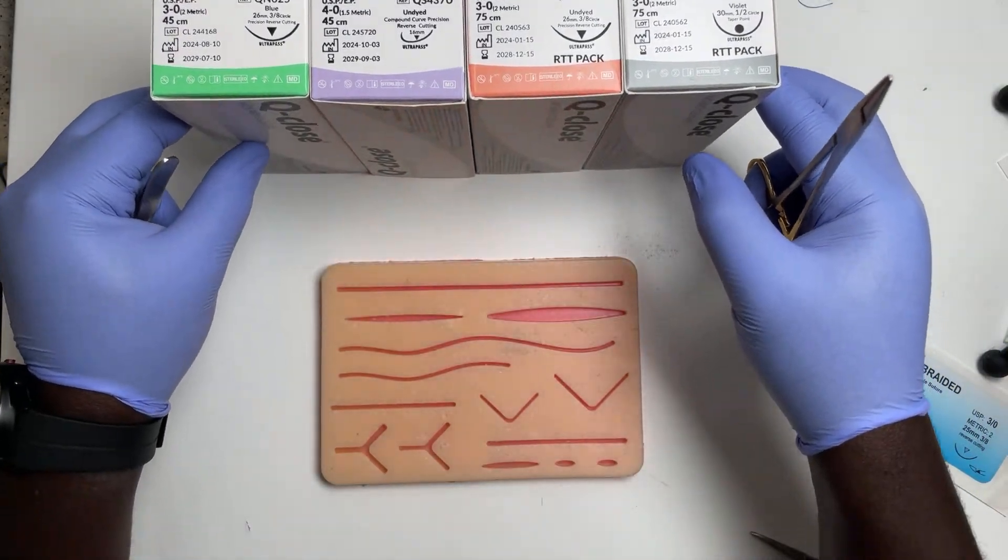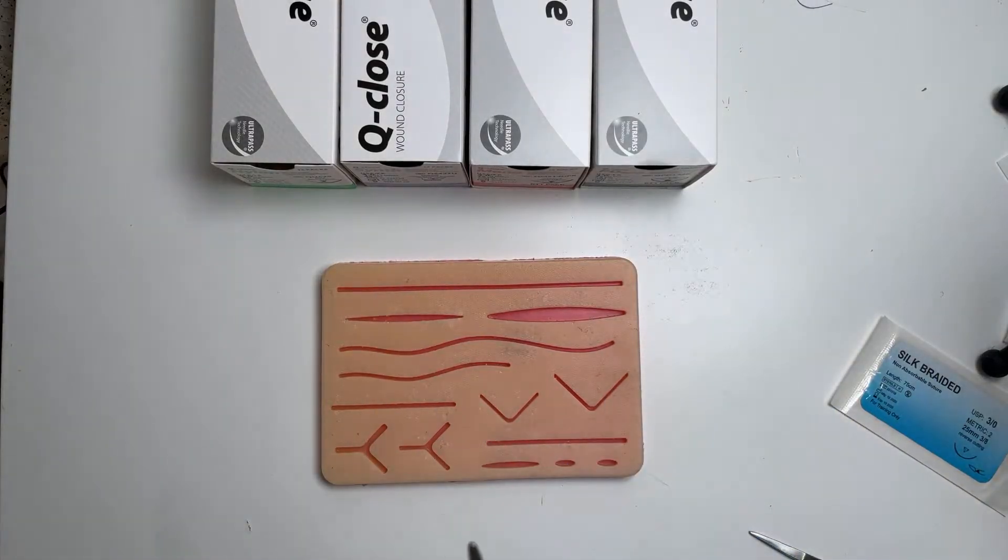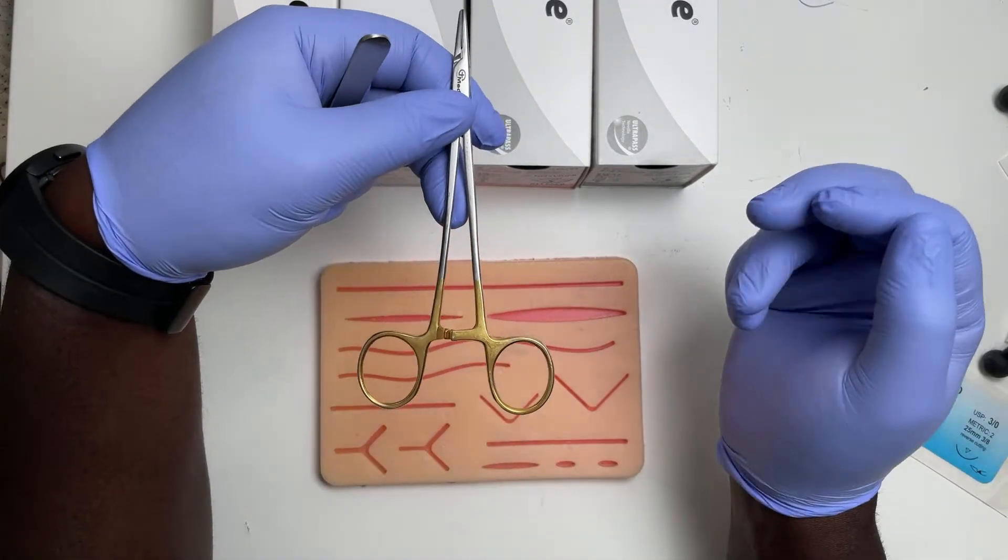We need to start with our basics. Our basics is the interrupted stitch. To do that, we have to hold our instruments.